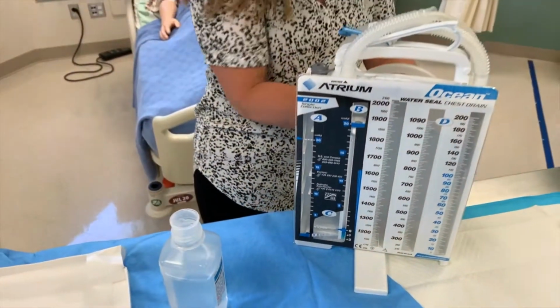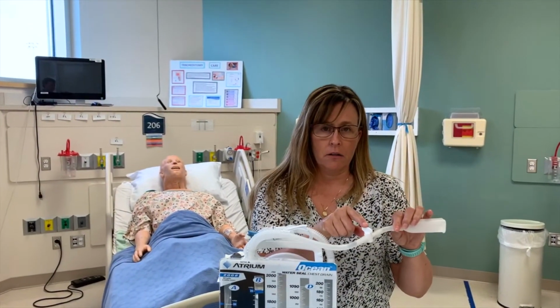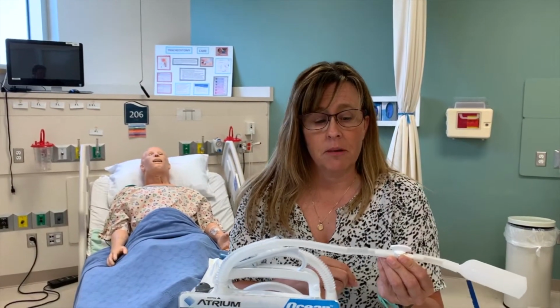Now it's important to note this little stopcock. Once you fill this, you are going to make sure it stays like that. Make sure it stays open.